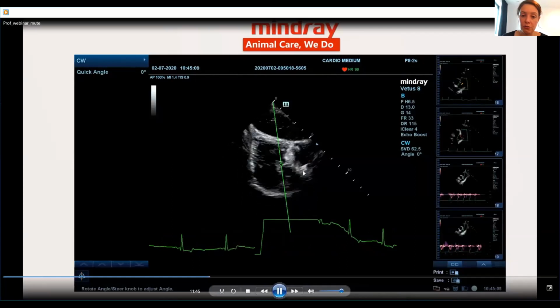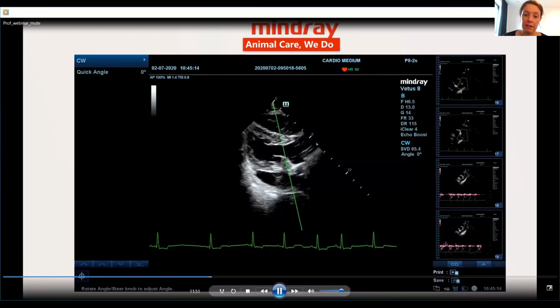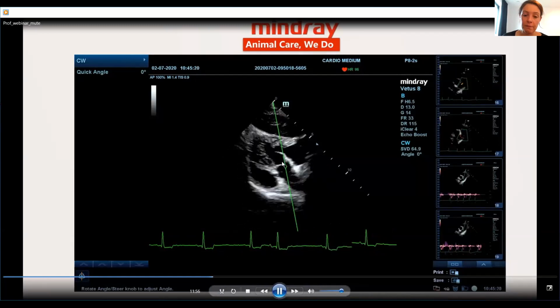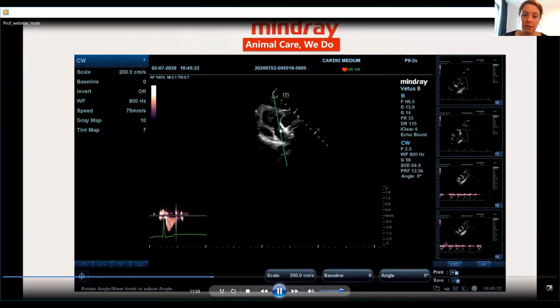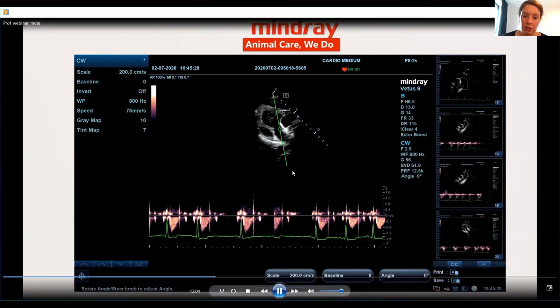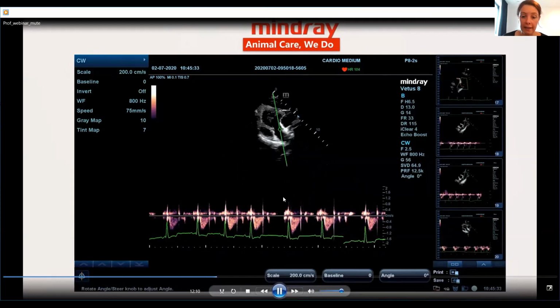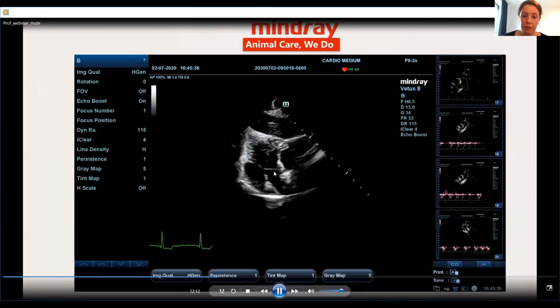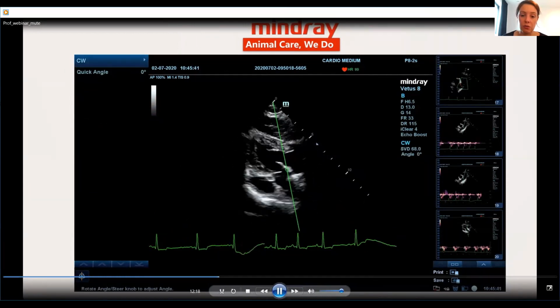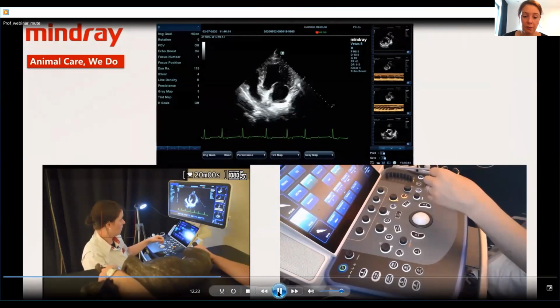What you try to do is angle your continuous wave Doppler as parallel as possible to the aorta. And here you see this different shape. This is not an actual sample gate. This is the continuous wave Doppler, and the continuous wave Doppler is actually measuring the velocity across all of the line. It's a continuous wave Doppler measurement because, of course, we try to measure high velocities and we are very deep. So then it's easier to use the continuous wave. Okay, so that was an illustration of the subxiphoid measurement.